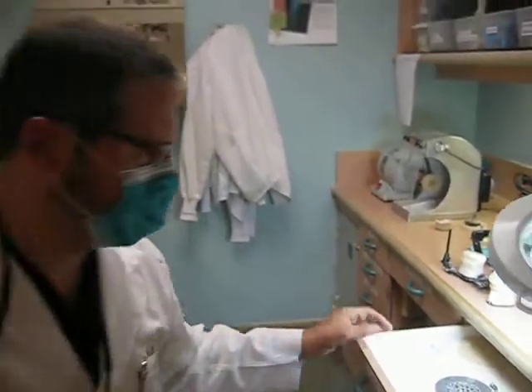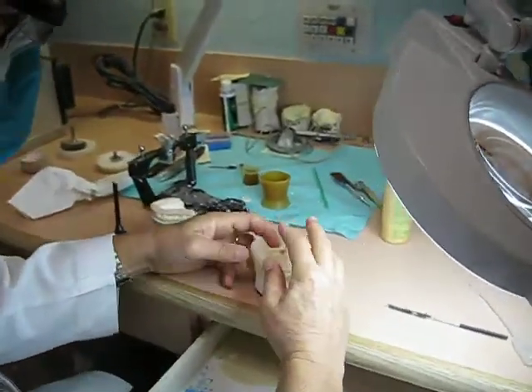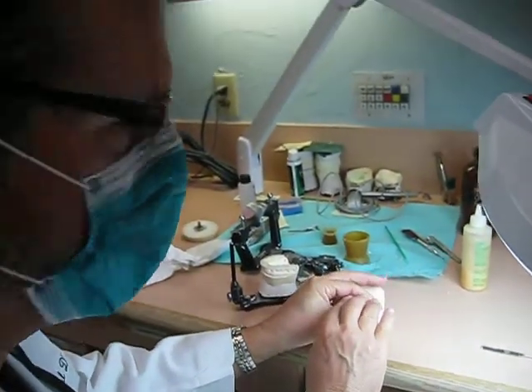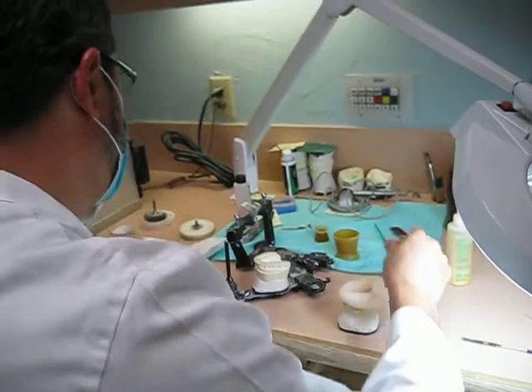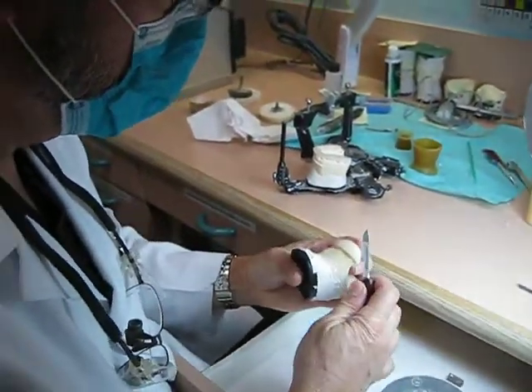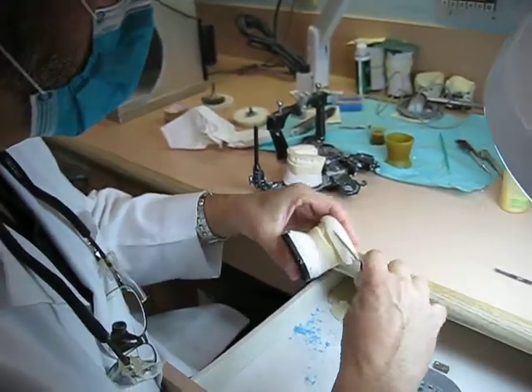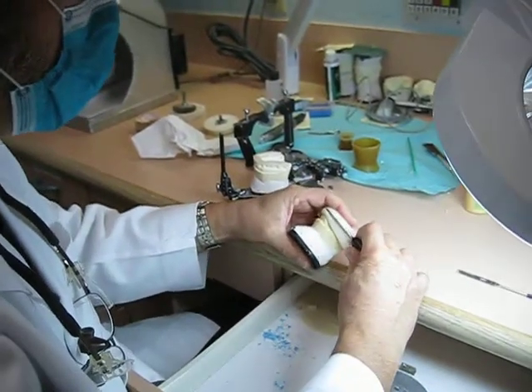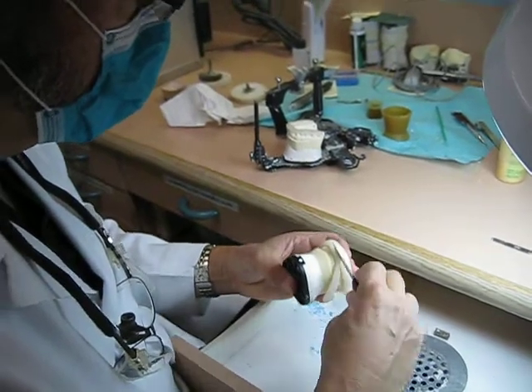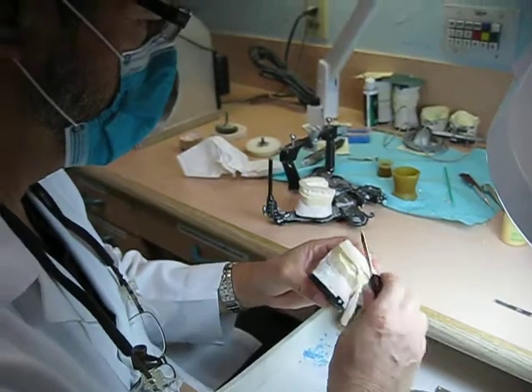Let me get a towel, wipe off the excess. So right now, I'm just going to continue to mold this a little bit. Now, this acrylic is really good. When you slow down the reaction in the cold water, you've got a little bit of working time. So what I want to do is take a scalpel blade, and I'm going to go along close to the tooth and gum line, close to the CEJ, which is the cemento-enamel junction on the model.